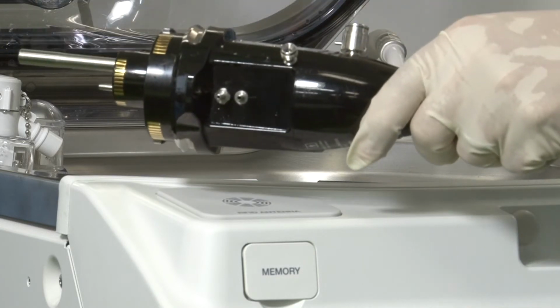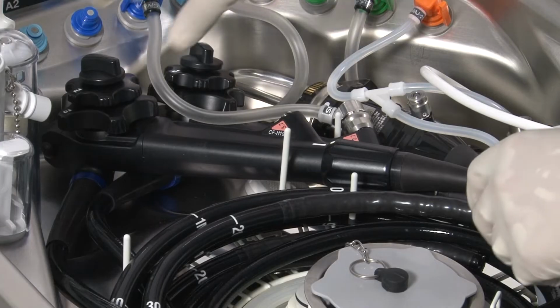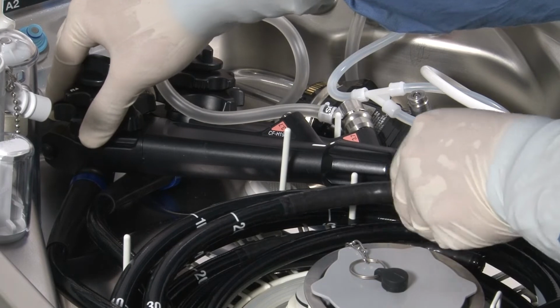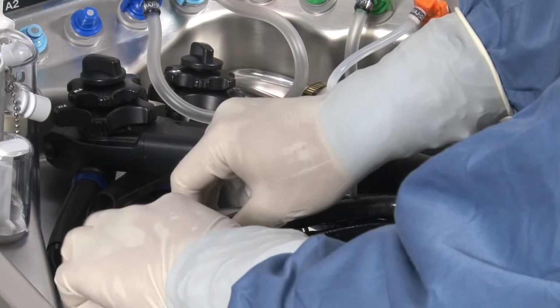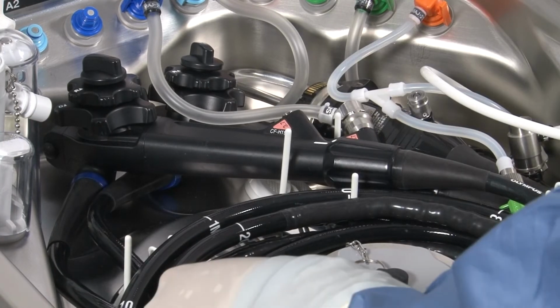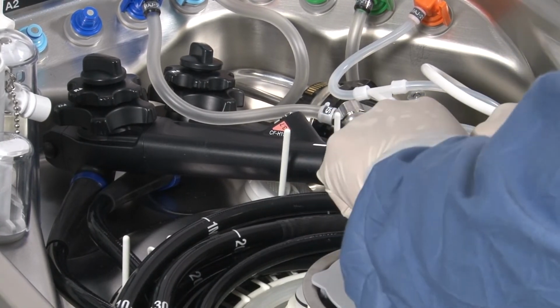If the ID tag is built in the endoscope, bring the endoscope connector in parallel with the ID reader of the equipment. Place the second endoscope's connector on top of the first endoscope's connector and adjust the position of insertion tube and universal cord to avoid overlapping as much as possible.